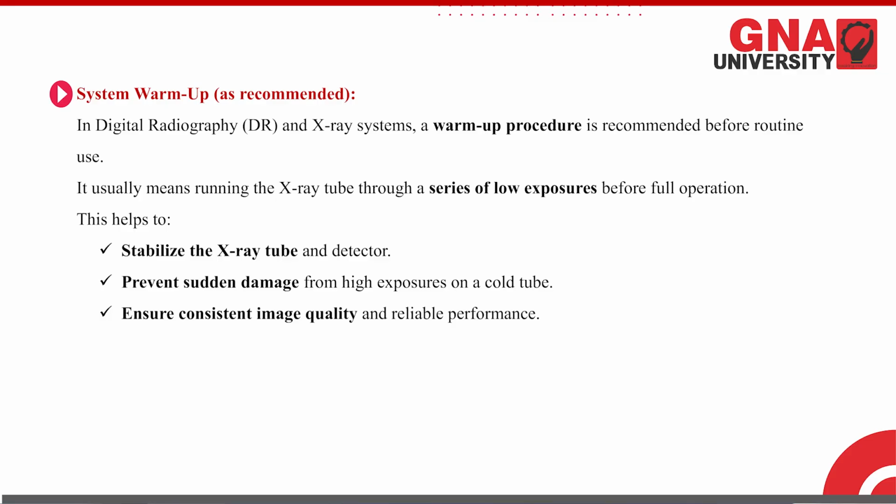By performing this system warm up, it will help us to stabilize the X-ray tube and detectors, prevent damage from high exposure on a cold tube, and also ensure constant image quality and reliable performance. Another thing is, it will also increase the life of the X-ray tube by reducing the risk of any crack to the detector, the cathode, or the anode.